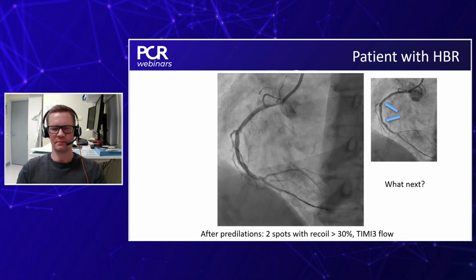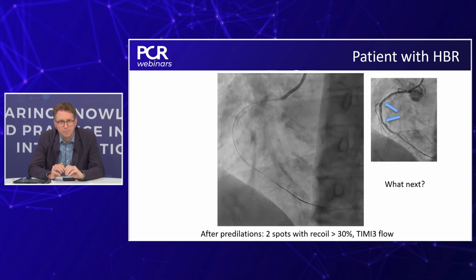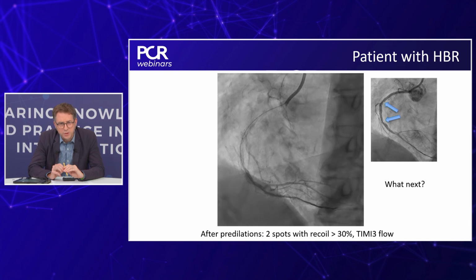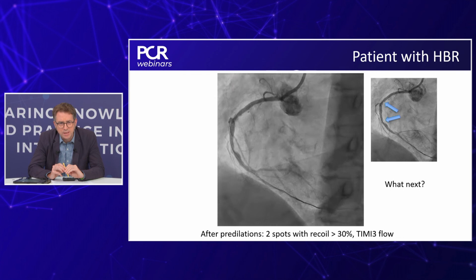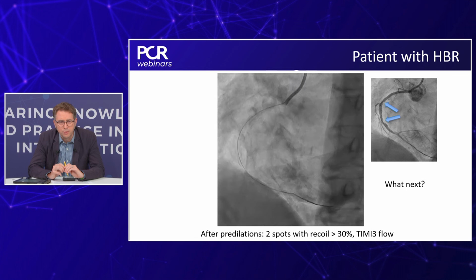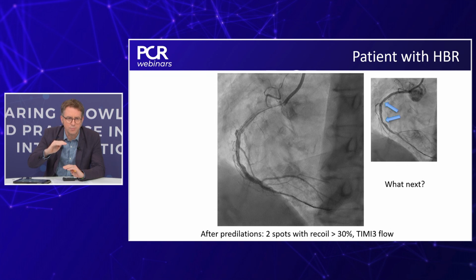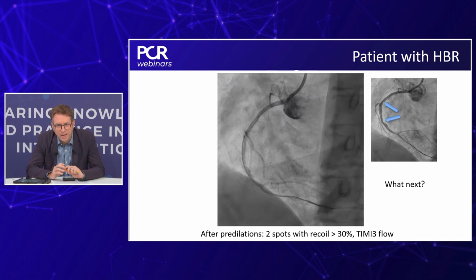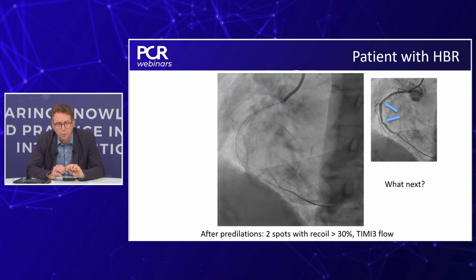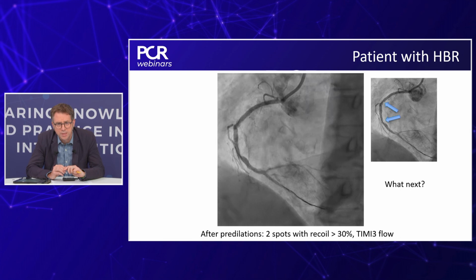So if we leave this up, Thomas, because it's a really important image, and certainly in my learning curve, this is something where I may have bailed out very quickly to stent. But we talked about the challenges around the dissection classification. We see clear evidence of vessel injury, particularly in the second segment, the second blue arrow on the still frame. But importantly, as I suggested in this simplified threatening, non-threatening classification, you see clearance of contrast, don't you? So there's no hold-up of contrast around that dissection. And importantly, the distal vessel, as you said, has enhanced flow, having had TIMI-1 flow at the beginning of the procedure.